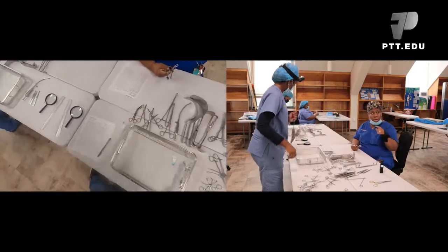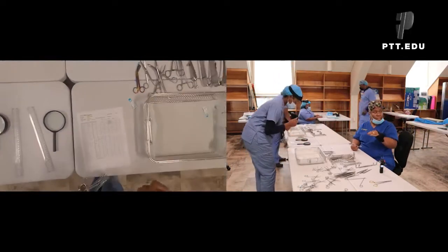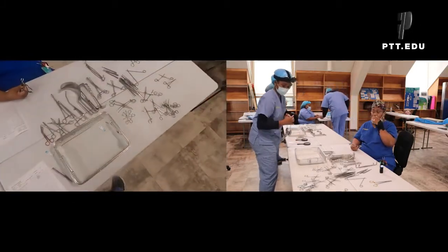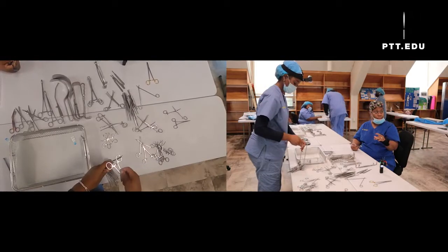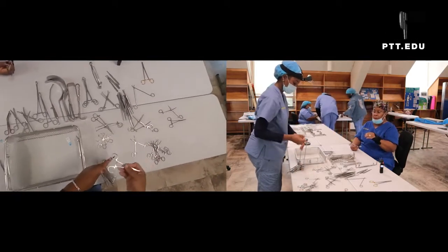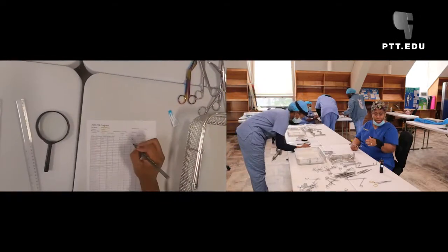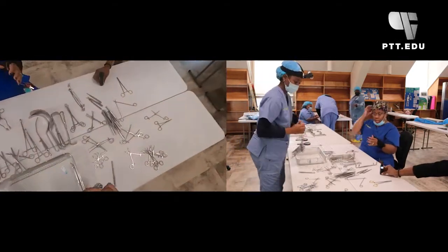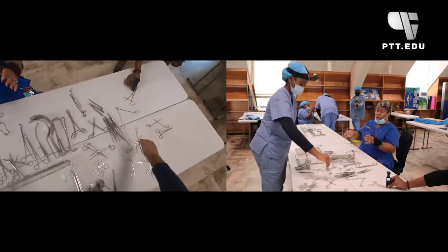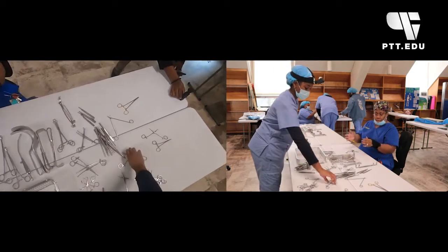Our number one customer is the OR. We are in business, honestly, to make sure that the needs of the OR are always met. So if the tray that she's putting together is called a general minor tray, it could be used for so many things. So there's this general instrumentation that's needed for this particular tray.